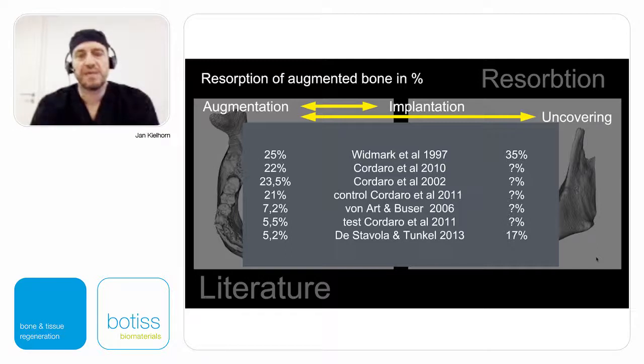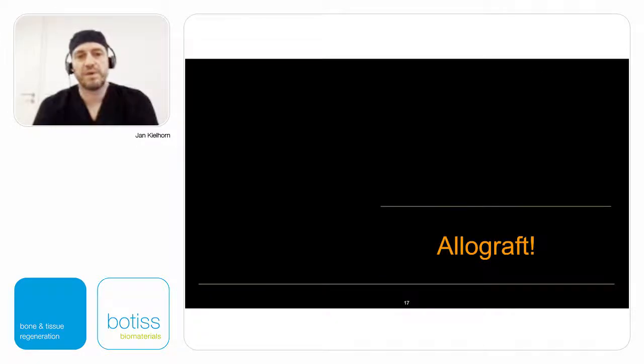Nobody has been taking care of that, and that shows that you will have an extra amount of resorption after the implant is placed. So the question is long-term results. Is it favorable to have also a sort of a natural material, also something that could copy natural principles, but will be more stable if you look at long-term resorption?